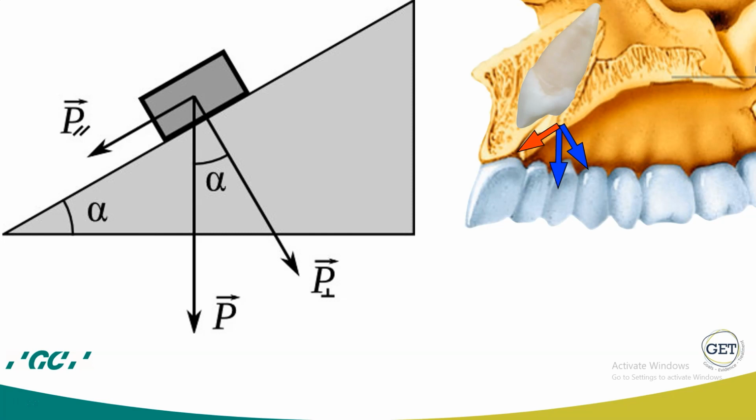He especially has to remove as much as possible of the bone of the palatal cortex under the crown of the canine. If the surgeon doesn't do so, when you start to pull down, the component that is in red in this image will tend to bring the canine still forward. And this has happened, making this canine resorb the root of the central.